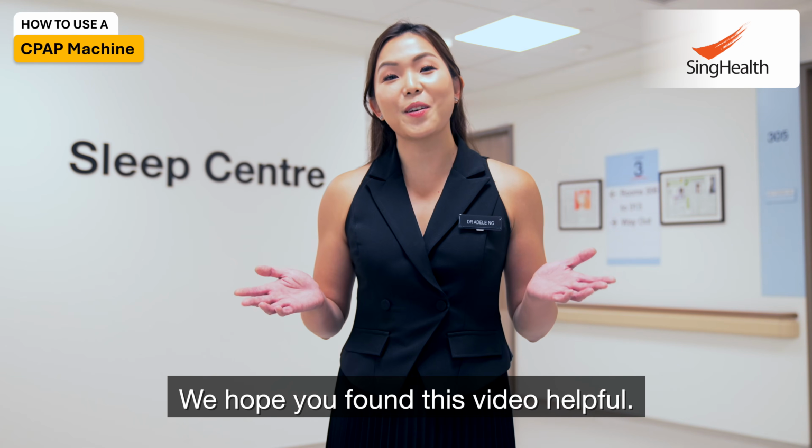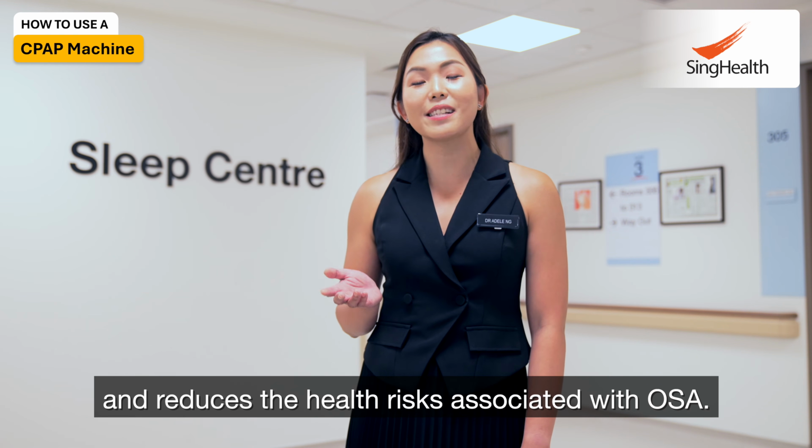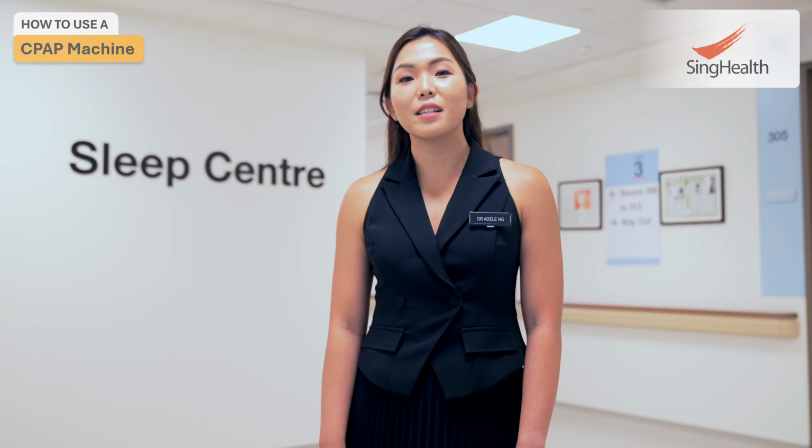We hope you found this video helpful. The use of CPAP improves your sleep quality and reduces the health risks associated with OSA. For more information on OSA or CPAP, speak to your care team.